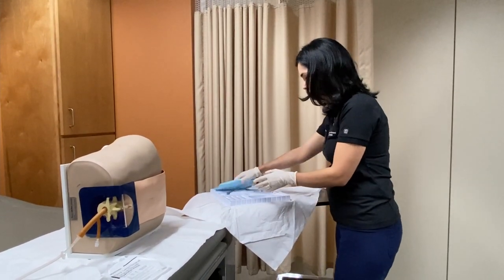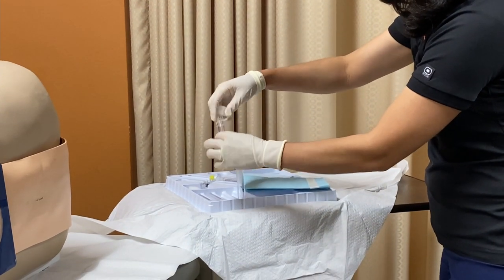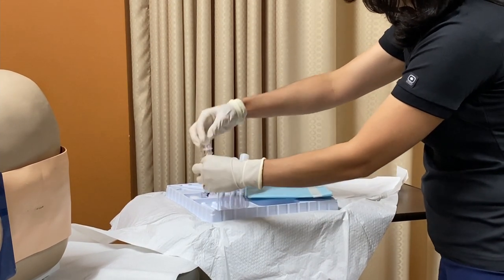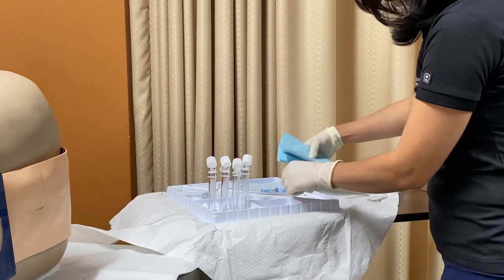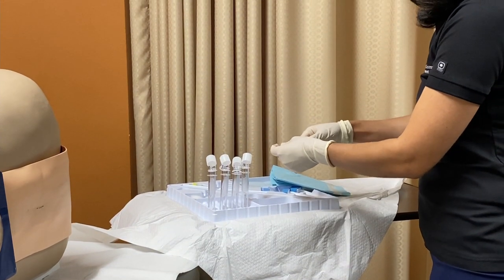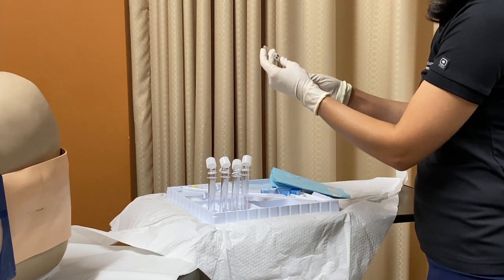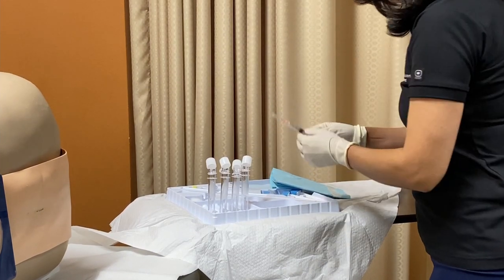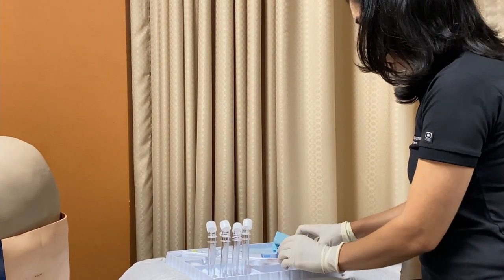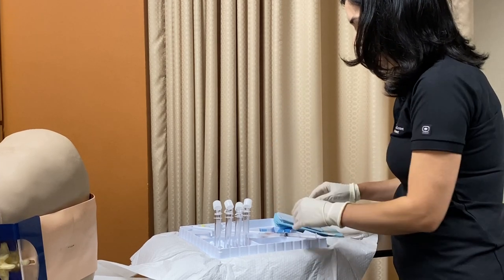Once sterile, prepare everything on your tray so it's ready to go. Open your tubes and make sure they're in order one, two, three, four. Prep your anesthetic by drawing up the lidocaine — two mLs — and switch to the needle for deeper anesthetic injection. Have your sponge sticks ready. The drape is also here.